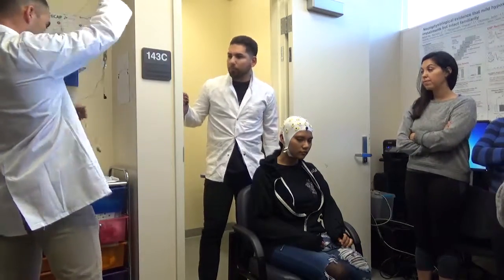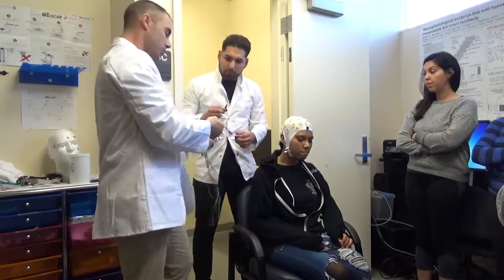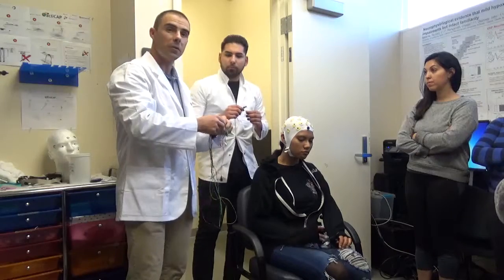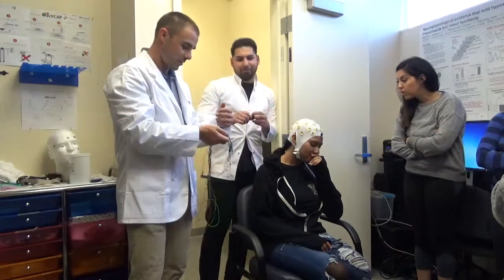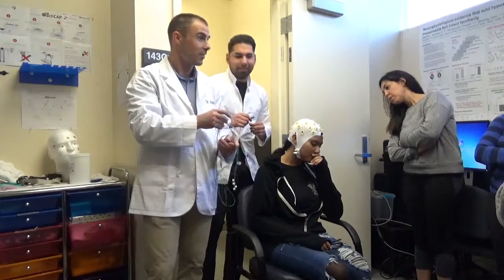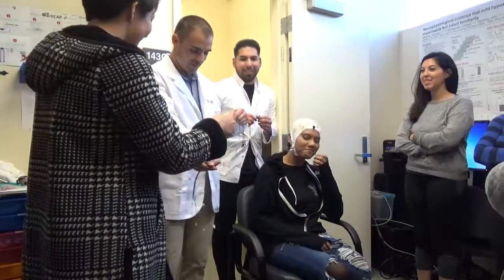You want to help me with this, maybe? Okay, so let's just take a look. Are there questions? Anybody else want to come in and help? You get to wear a lab coat. There's more. We saw lots of ladies' lab coats in there. Very spiffy too. Yeah. Nobody? Anybody? Alana, you want to help? She said, I don't need no lab coat. She brought her own.